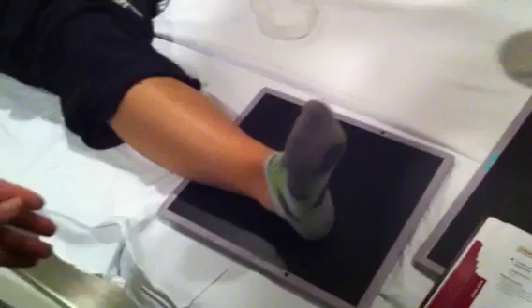An eversion. Forty inches perpendicular to the ankle joint, midway between the malleoli. So this is not a rotation with the leg — this is a rotation with the foot. You're going to center between the... You can twist your foot pretty good.